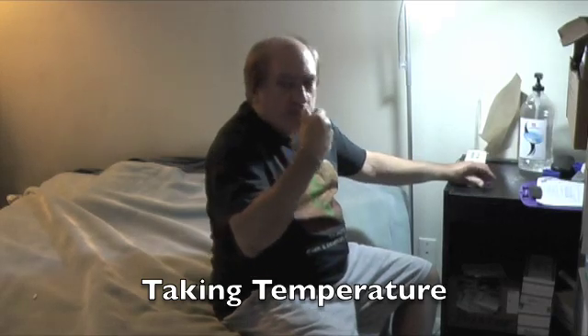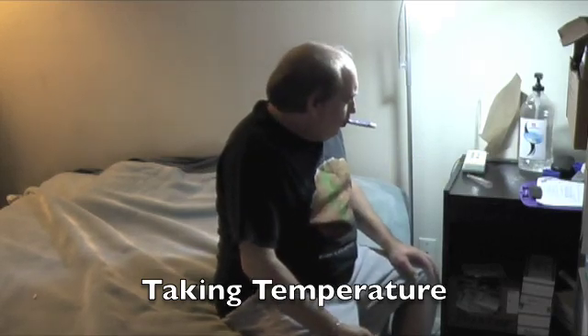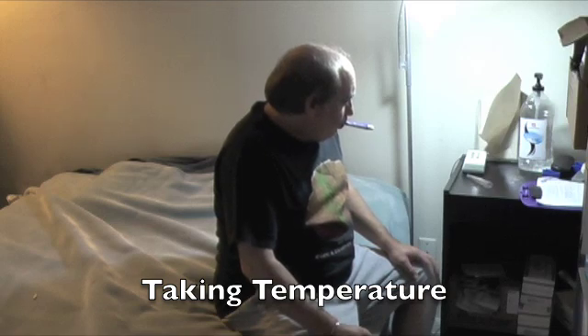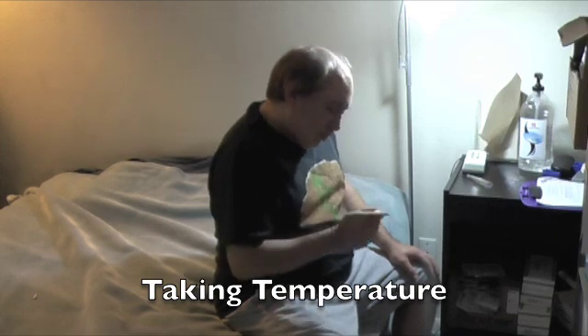Next I'm going to take my temperature. The reason you take your temperature is to make sure you have a normal reading — if you have an elevated temperature, there's a good chance you may have peritonitis, which is a very serious infection of the peritoneal lining. So we always take our temperature every day. As you can see, I am taking my temperature here.